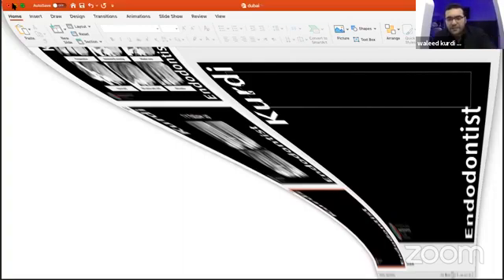Is the file separated in the area of the ledge? How can we deal with it? Separated in the area of the ledge. X-ray will help you a lot in such cases, and also combine CT if you can do it. What is the protocol of retrieval?